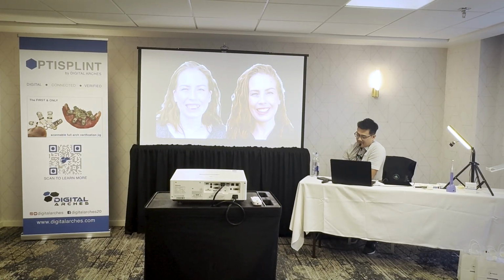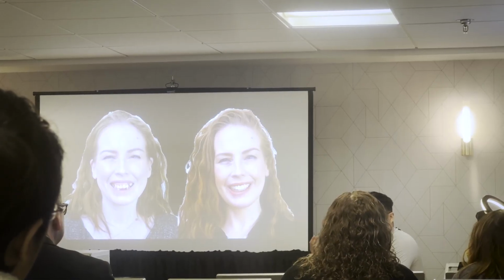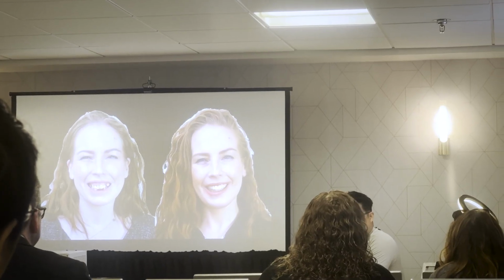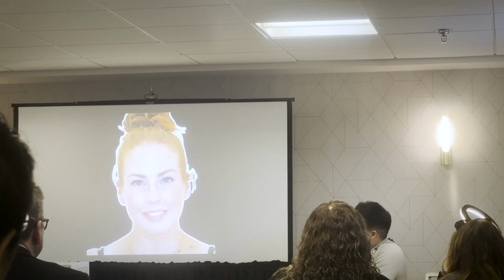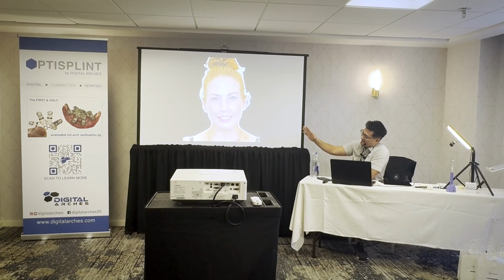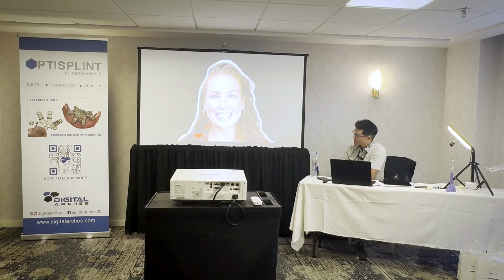These are pre-op. And then what happened was she started missing all of these follow-ups because the dentist would call her like, hey, why weren't you here today? She's like, oh, I've got a new boyfriend. I'm in Seattle because that's how she looks like now. This is a month ago, and her midline is just slightly to her left, and so here's her before and after. And so Gaetano designed new temps, and this is her with the new temps.